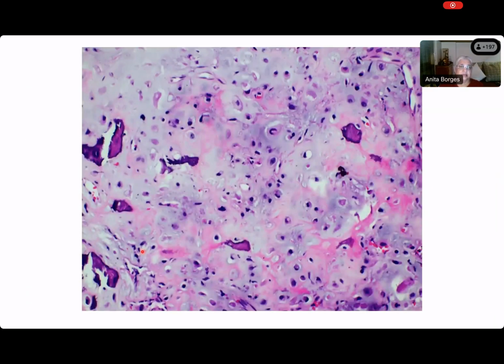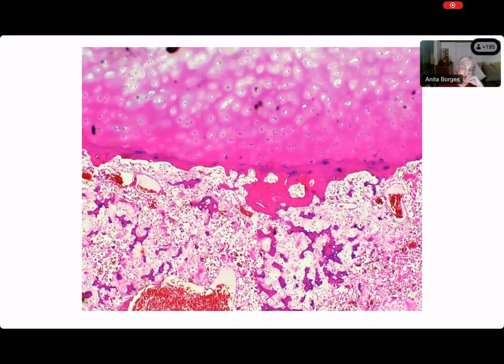Ma'am, it appears more bluish. Yes. So now this, just take a good hard look at this. Everybody's looking at it, because if Sarangi cannot articulate what she thinks, then others have to. Now Sarangi said that all of this, which I am showing you with my cursor, there is more cartilage, much more than there was in the needle core biopsy, which we called a tumor, right?